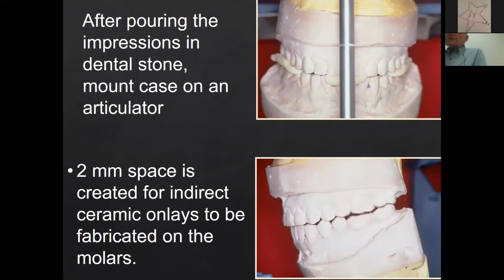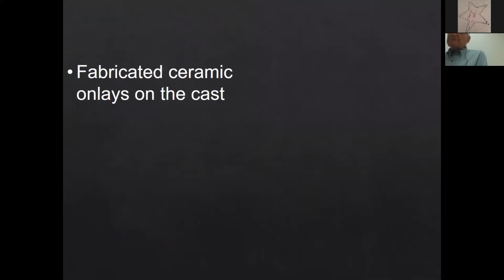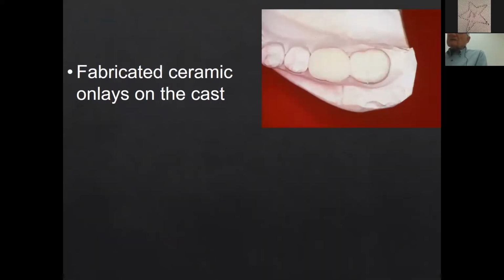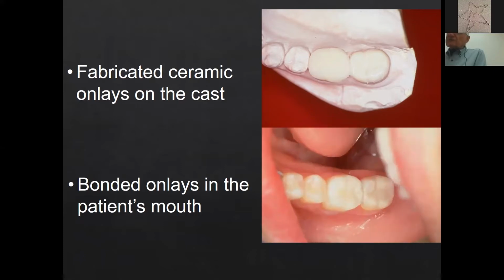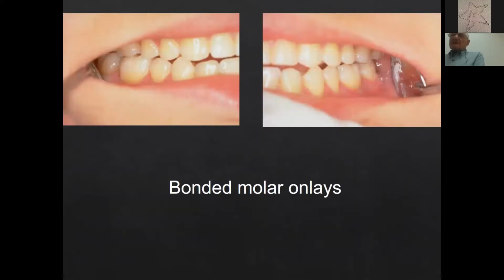So now in this photograph, you can see the space created, and these indirect ceramic onlays can be fabricated on the model. So this picture shows the fabricated onlays, and then the onlays bonded in the patient's mouth. Looking at it from the side, we can see how we've now established the posterior segment of that new bite opening.